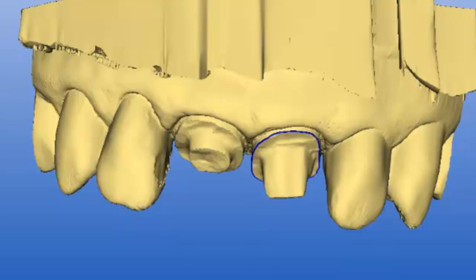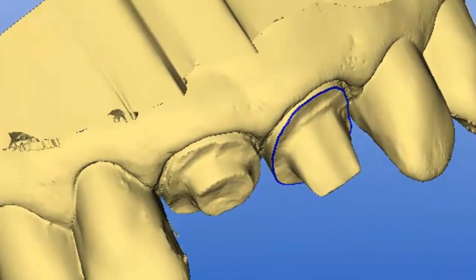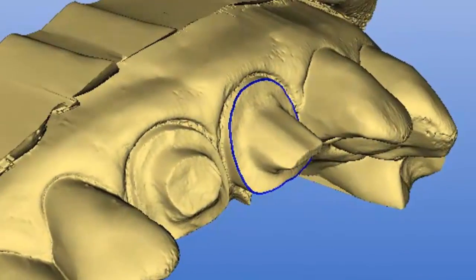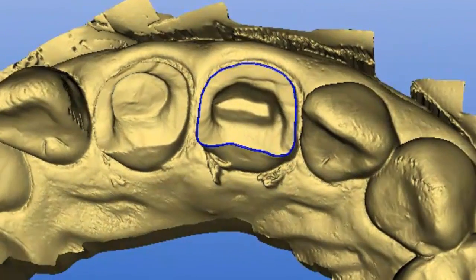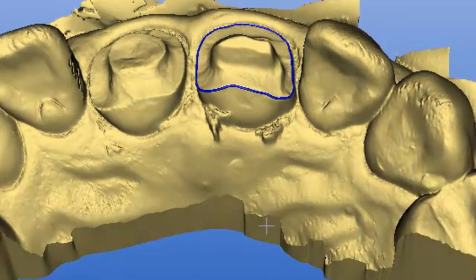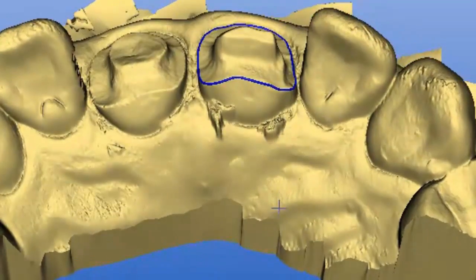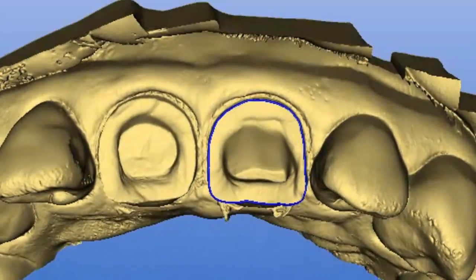And you can see this is a Bluecam case. As we look a little closer, the broken one is pretty flat there on top, only a couple of millimeters of wall on the facial and the lingual. There's a little more length on the other incisor because it wasn't broken off so badly. But those are pretty small preps, pretty short teeth that we have to bond to. However, with the bonding capabilities we have now, I felt confident that this would be fine.